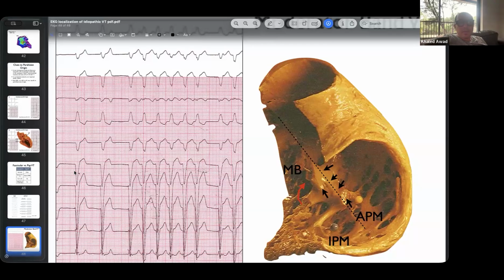And you'll go in there and you'll find really good pace maps, and you can ablate there too. It's not going to get rid of the problem, though. The scar is a little bigger than what you can access through the middle cardiac vein.